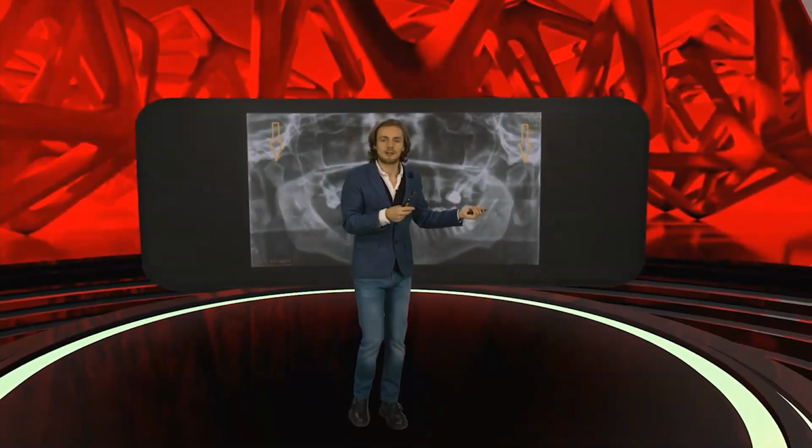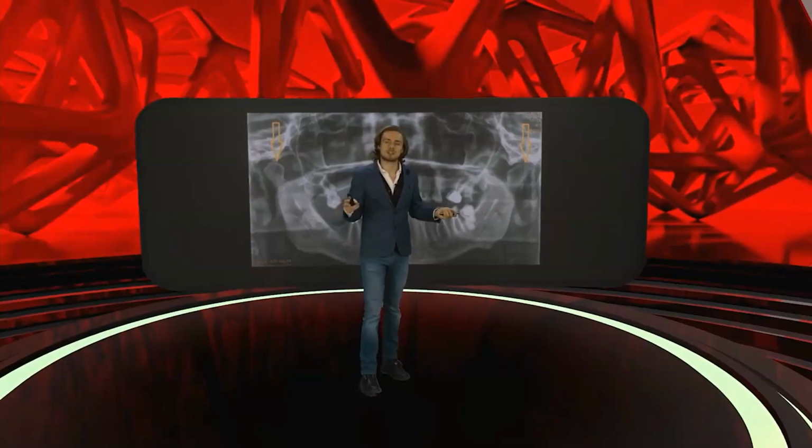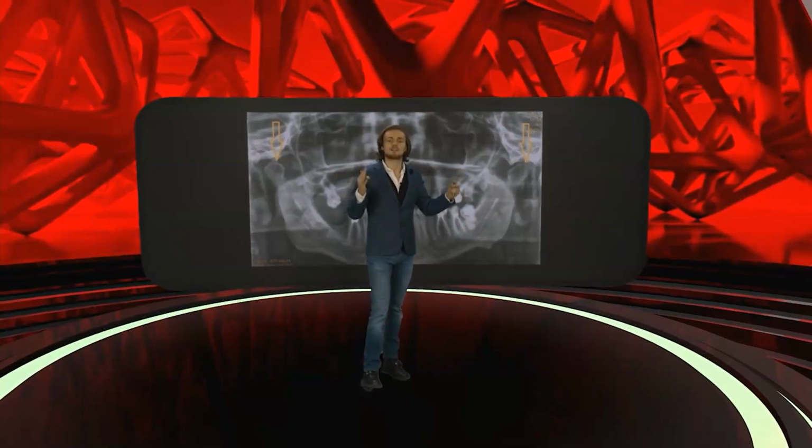But what does it mean, something wrong? Does it bother your patient? Does he feel okay or not? What's his problem? Why do you think this is a problem at all? Maybe this is just a chronic degeneration that lasted over the last 30 years and the adaptation is done. So questionnaire and examination, not only panoramic X-ray.